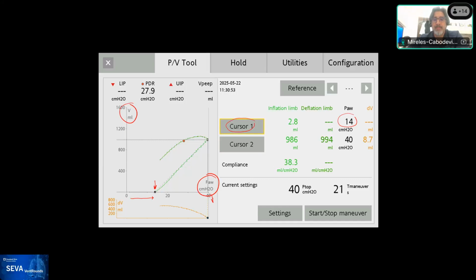Rob? It might be confusing to some people that you said a little bit of volume is being introduced, but you can't see it on that scale. Where is it being introduced? Well, into the compliance of the patient circuit. Correct. And this paper that I just put in the chat explains all that. Thank you, Roberto.